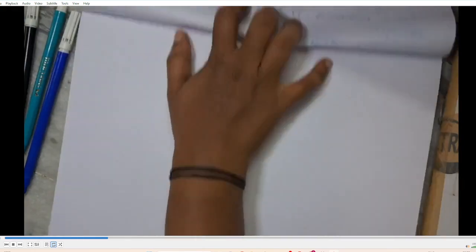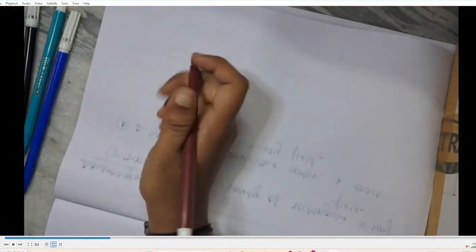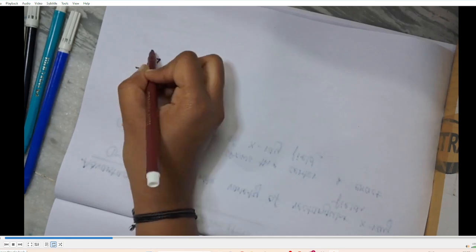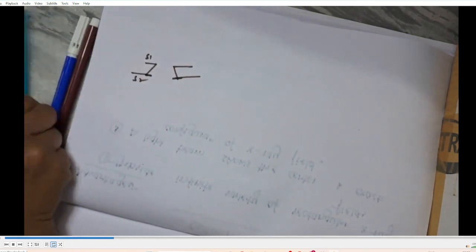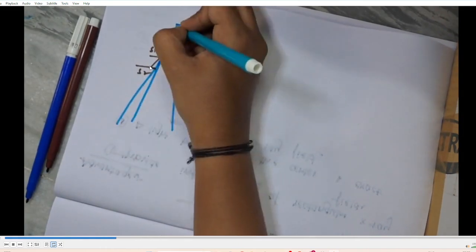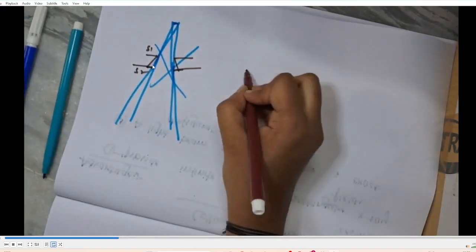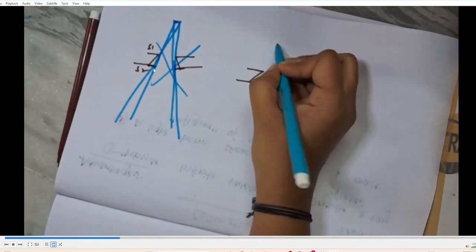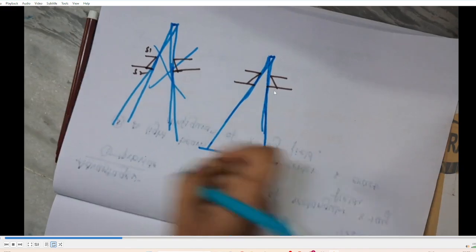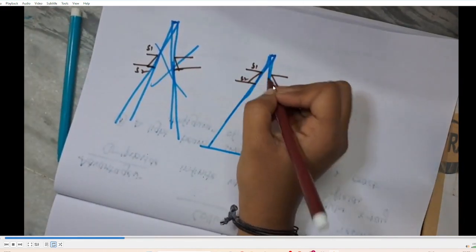In this collimator, there are two sets of shutters which control the beam dimension. This is shutter 1 and shutter 2. These two shutters move together as a unit, so the second shutter aligns with the first to clean up the penumbra.